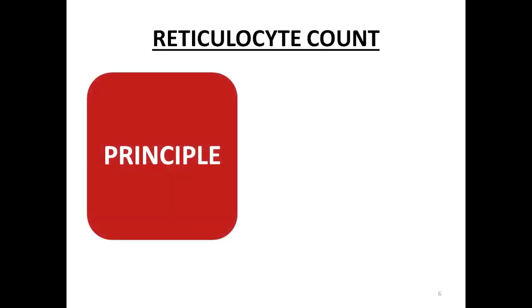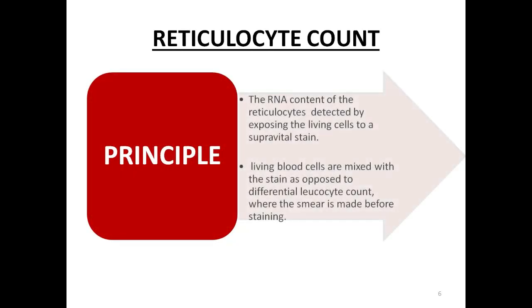Now the principle of this practical, that is, the reticulocyte count. For this practical, we take 1 to 2 drops of stain and 1 to 2 drops of blood.